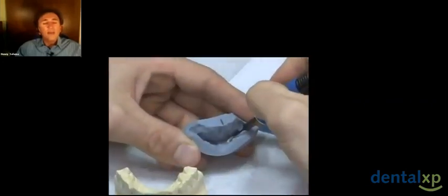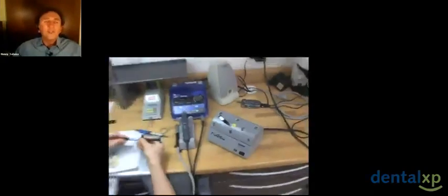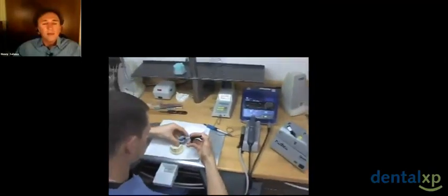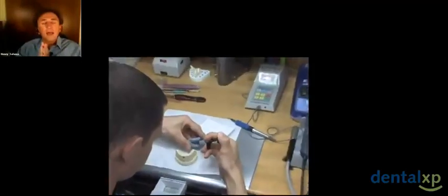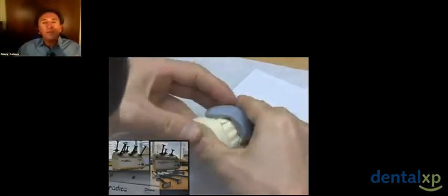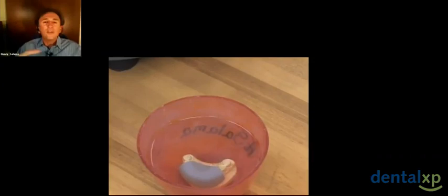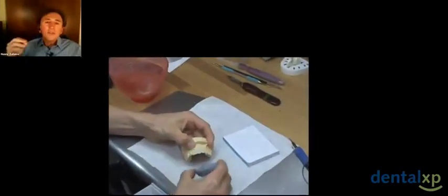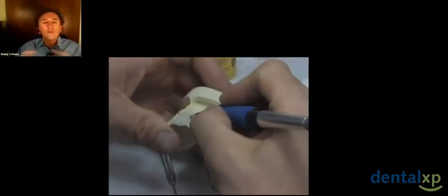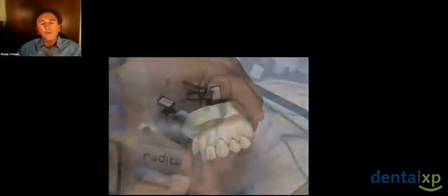and fabricate a final abutment as well as a temporary, so that we can facilitate a very efficient placement of the implant according to our treatment plan, very, very precise in orientation, and at the same time have available to us right at the chair an abutment that's designed for the tissue type that we have, and we can then put in the final abutment at the time of implant placement so that that connection becomes the most durable without having to put on and take off many different components through what is a normal standard cycle.